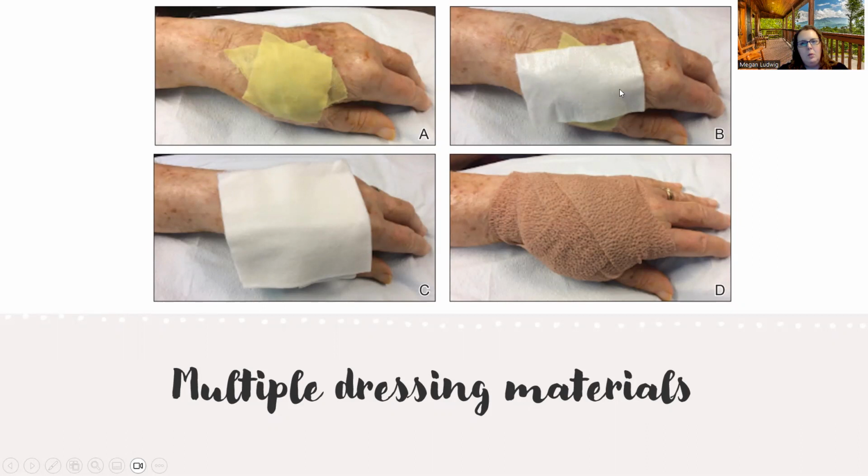Over here in letter B, you have Telfa. Telfa is a non-adherent type of dressing, or could be used for specimens. C is an absorbent layer, so that's a nice absorbent gauze. And then something to secure it. So this has no sticky on it over here in C.